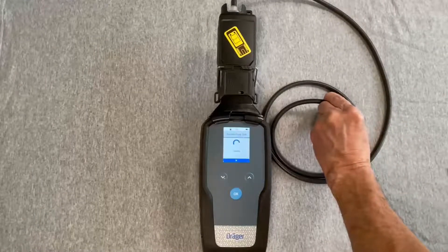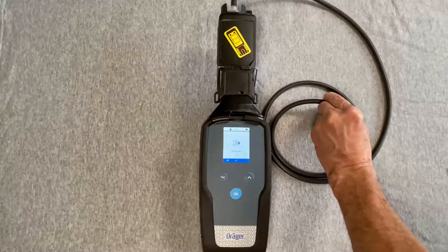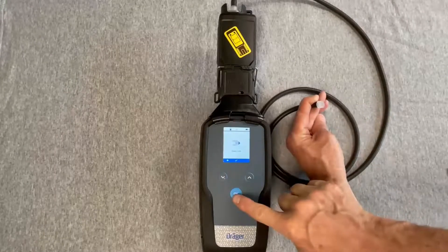The device is conducting a leak test. At the open inlet prompt, open the inlet and press OK.